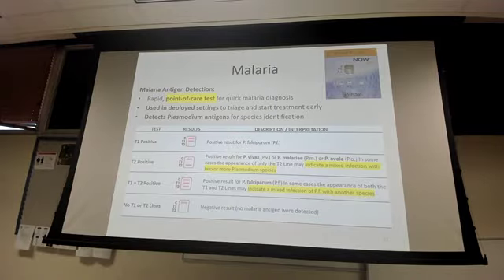All right, so this is point of care testing, which is very applicable to you all. That's an example of what one looks like. Yes, when I was deployed, we did use these for a little bit, but of course, we always followed up. We still ran blood, we still sent it back to microbiology for confirmation testing. But if you just need that initial response, positive, negative, this is good, okay? It'll help triage, and it'll help if you need to go ahead and treat your patients. I'm not going to have any pictures like this, but just know, point of care is going to give you that quick yes or no.